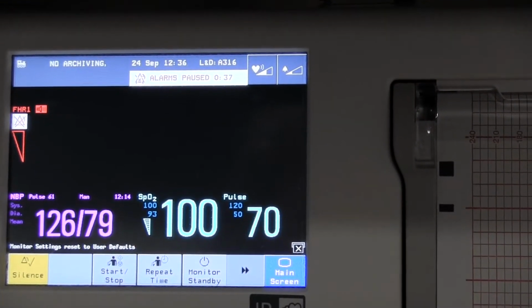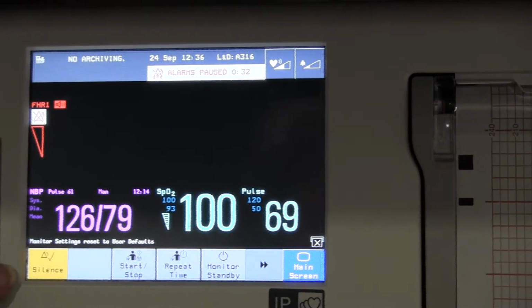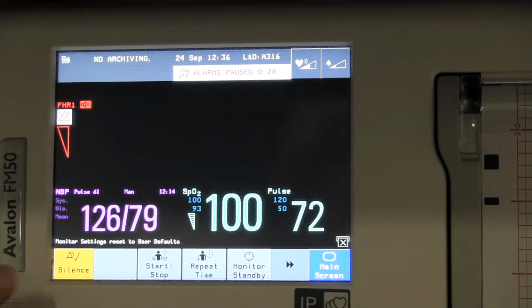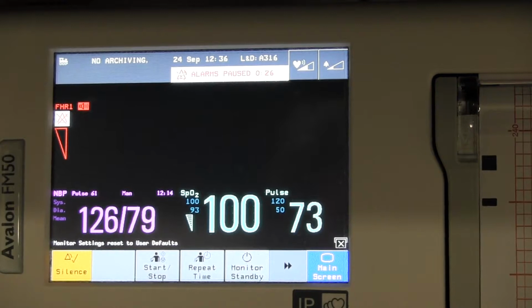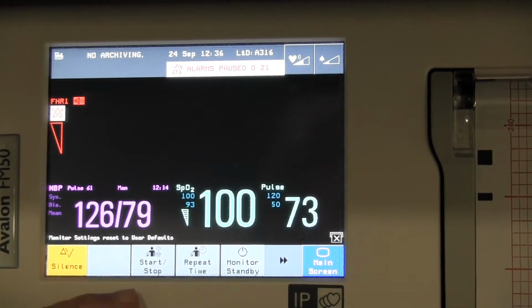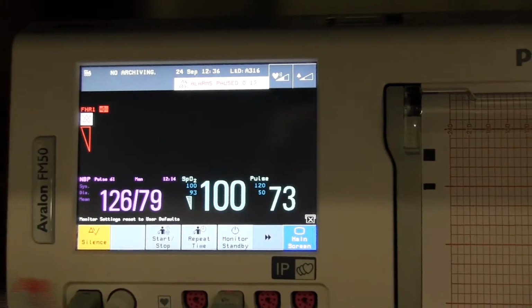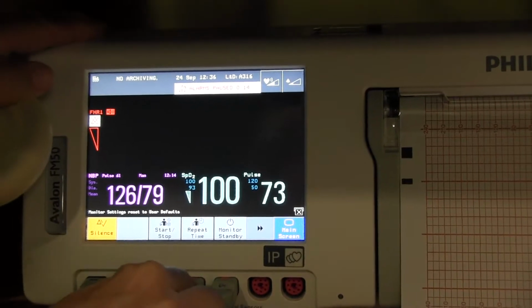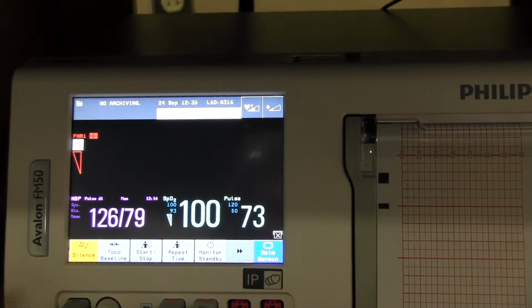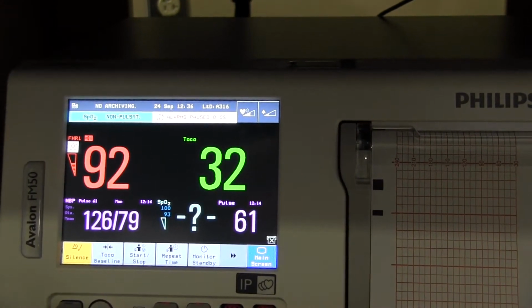There are alert keys on the top and smart keys on the bottom. Some of the smart keys always remain permanently on the screen, such as silence and main screen. Additional smart keys depend on the functions being used. When you plug in the TOCO, the baseline key appears. These keys appear when they are needed. To show additional keys, push the arrow button next to the main screen.